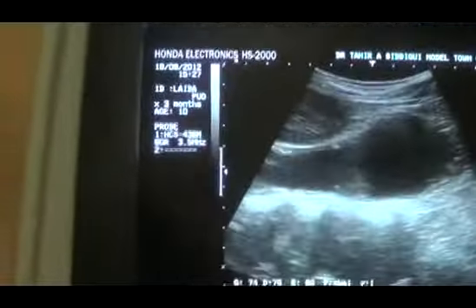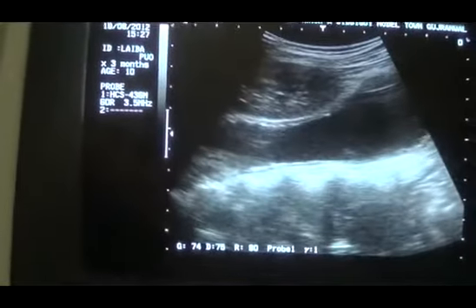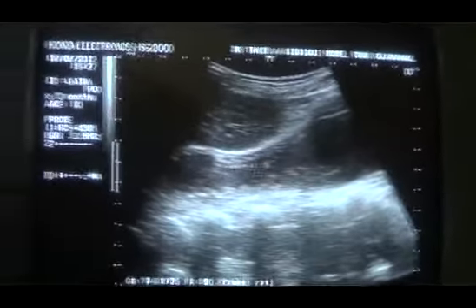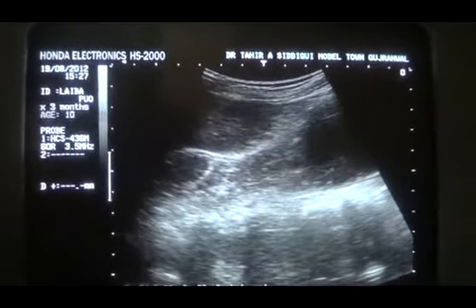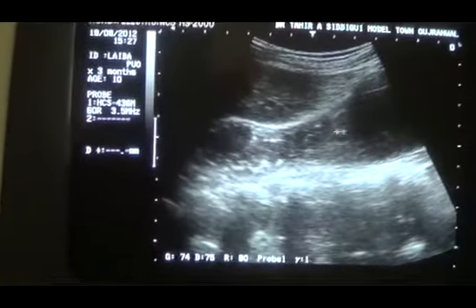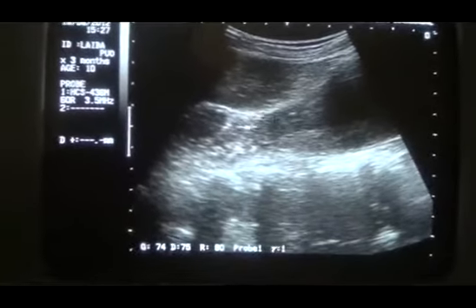That has made this cystic area sterile. Why? Because we are not seeing that many internal echoes or pus. Otherwise, the abscess gives the appearance of this area. As you are seeing in this region, the abscess pocket usually gives the sonographic appearance consistent with this region.